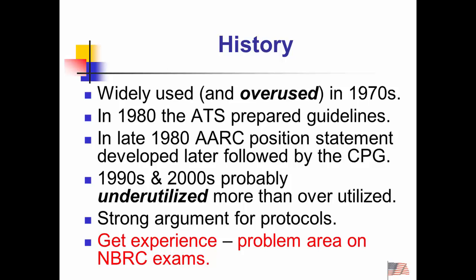Let's talk a little bit about the guidelines. When I started in the profession in the late 70s, it was widely overused. It was the primary mechanism by which we delivered medication. We didn't have the handheld, the small volume nebulizers. Rather, we used this. It wasn't until the 80s that we started to see position statements both from the American Thoracic Society as well as the American Association for Respiratory Care developing. And now the problem is that the pendulum has swung the other way, and we're probably underusing it where we should be using it.